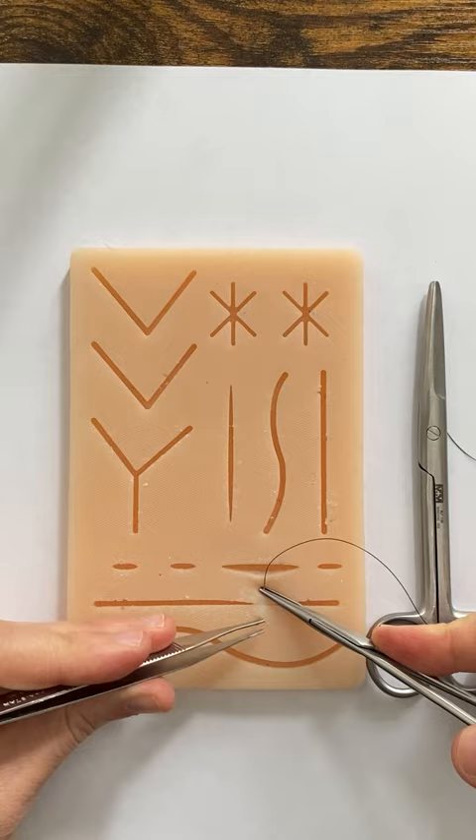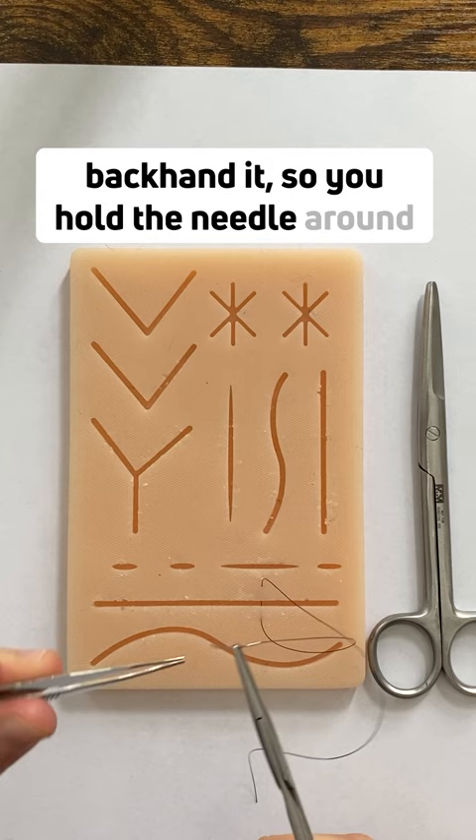Now you need to pull the needle. Then you have to backhand it, so you hold the needle around the same distance between the upper and the middle third, but now you're going this way instead of coming that way.